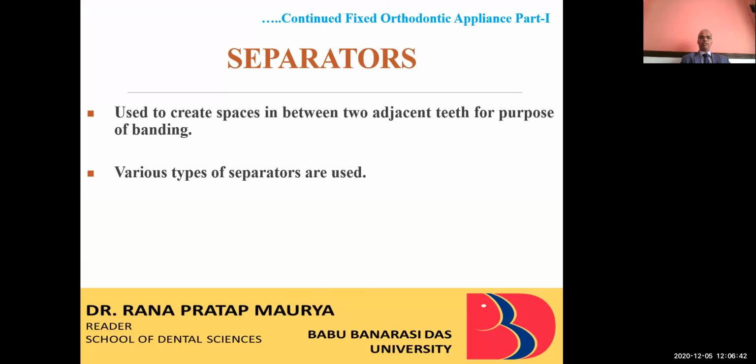So now I was discussing the components of fixed orthodontic appliances, the passive components, and other parts I have discussed in the first part of fixed orthodontic appliances. In the second part, I will continue with the remaining components and various orthodontic appliances.